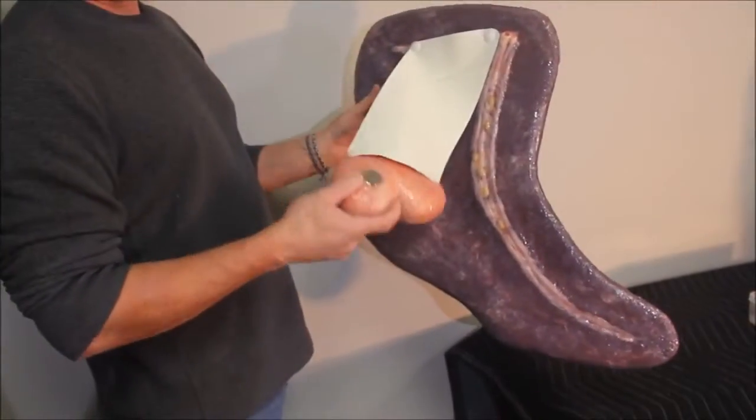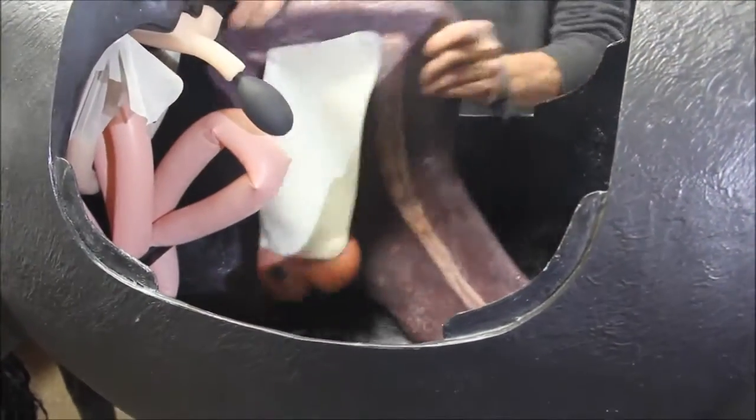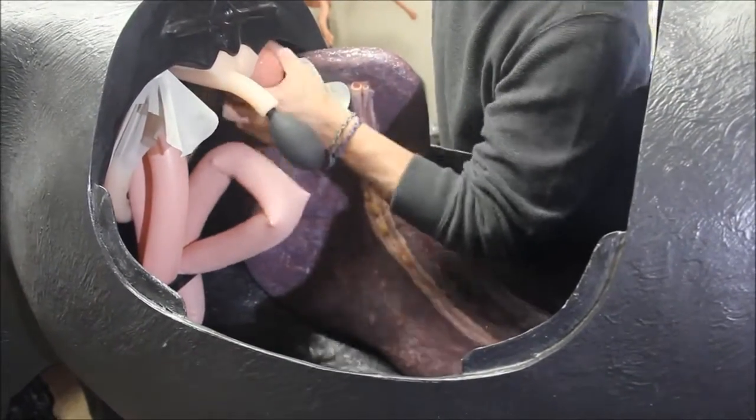A replica spleen and left kidney are attached with a representation of the reno splenic ligament. Both the kidney and spleen have magnets which connect with those situated within the horse's left body wall.